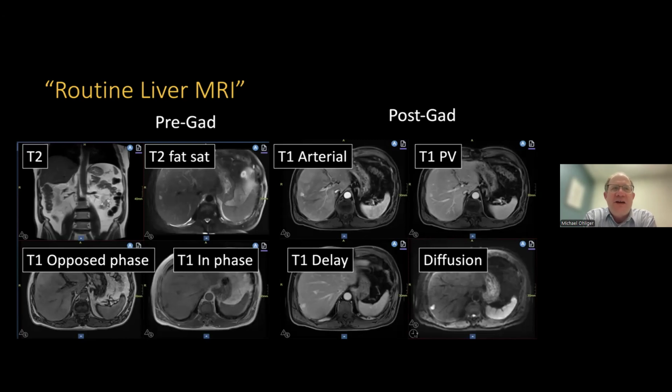So by default, it's 3. Some people acquire 4. Actually, at UCSF, we acquire 4 phases, and I could talk sometime about why we do the 4th. So 4 times is probably a good rule of thumb, but the amount of radiation is really just related to the number of contrast phases you acquire in CT. Exactly. Great. Good. Cool. Excellent.